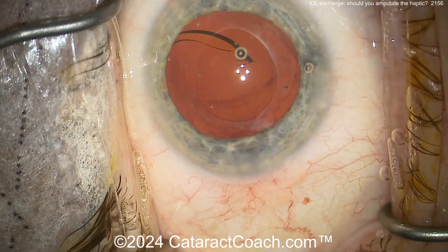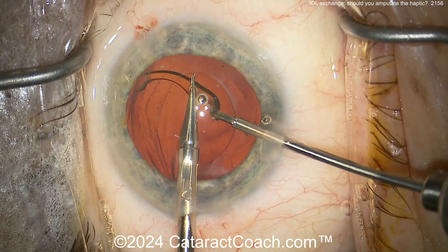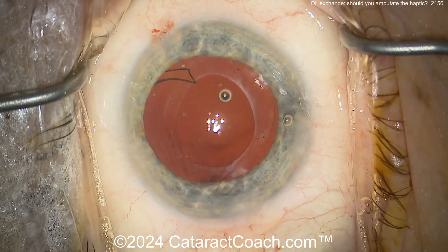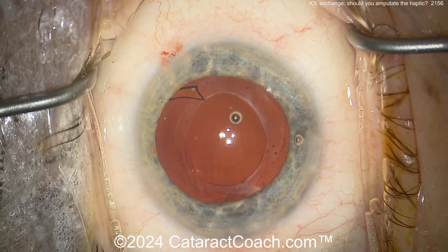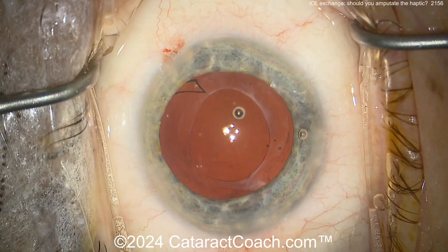I don't think it's a good idea to yank this out anymore. At this point, I would just amputate a little bit more and leave it in the bag — it's okay. It'll be fine in the bag. Get your new lens in and you can finish up the case.